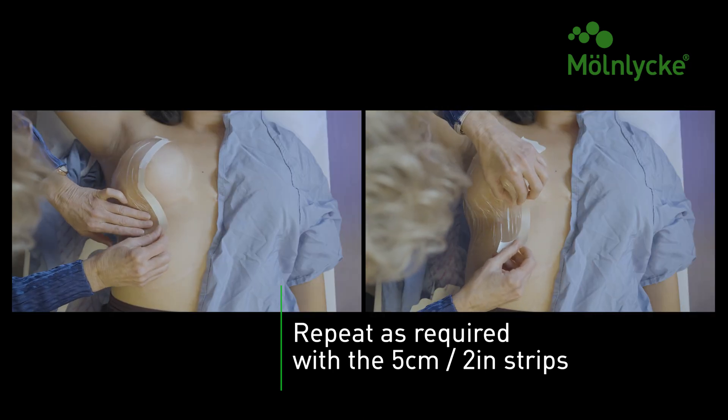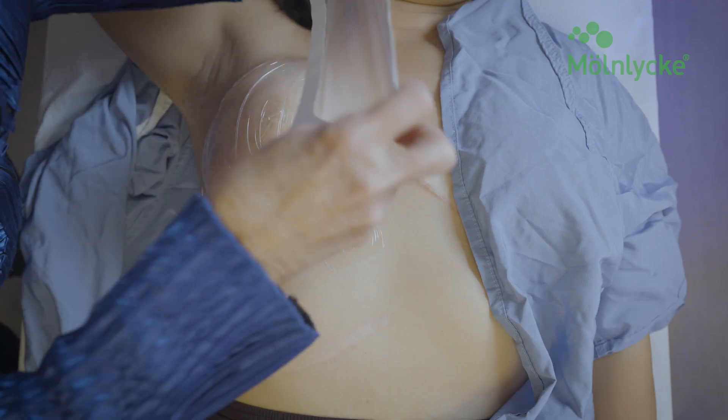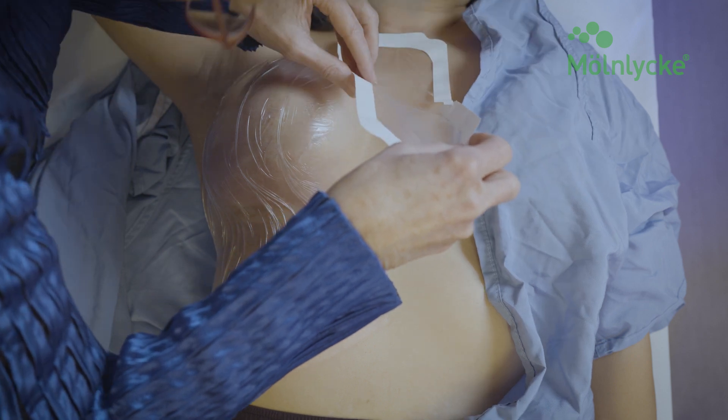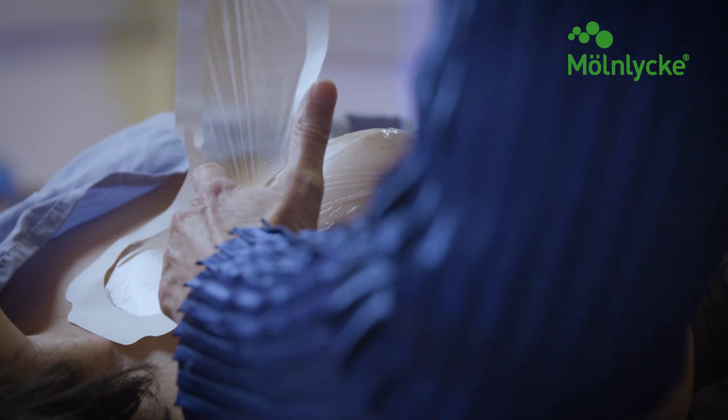Once the breast and upper abdomen area is covered, place the final piece of film starting at the clavicle and laying it down to the upper abdomen, including coverage of the sternal area, ensuring you are 2.5 cm beyond the tattoo mark.